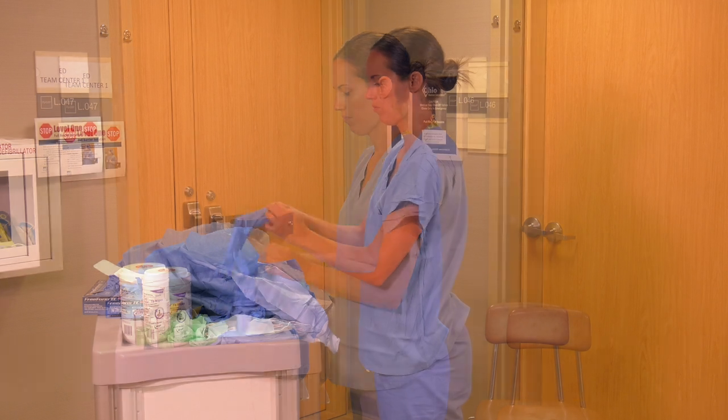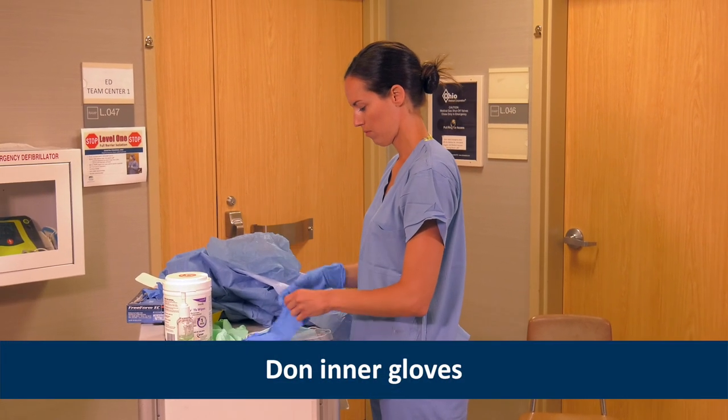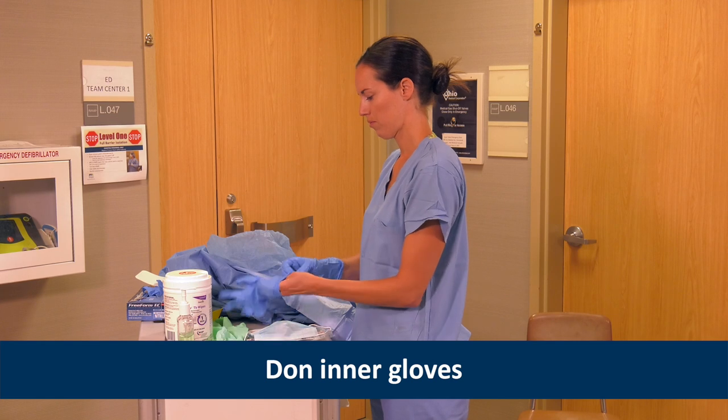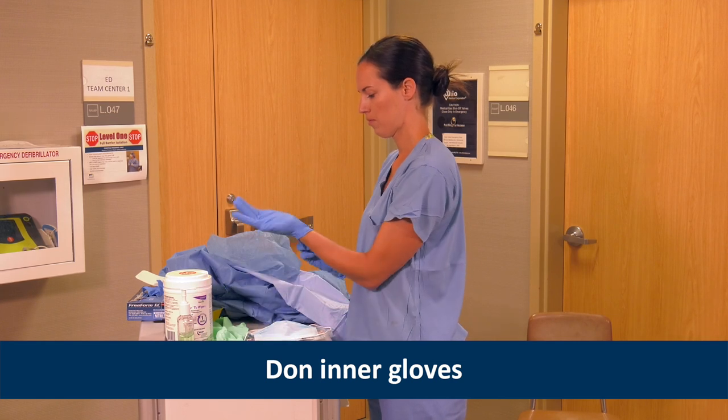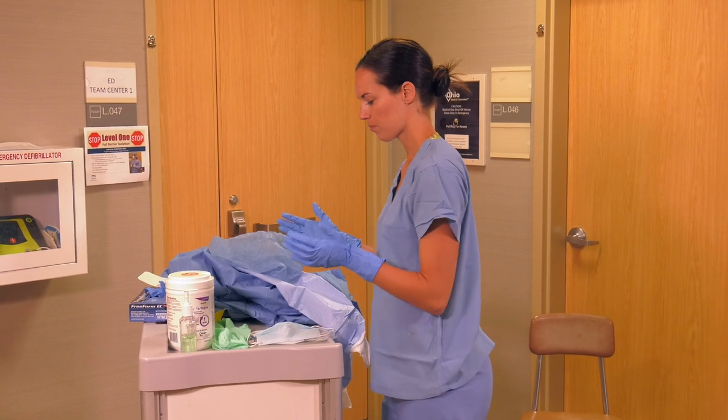Since Heather suspects viral hemorrhagic fever, or VHF, she dons inner gloves with extended cuffs. If a respiratory HCID is suspected, she would put on a single pair of gloves later in the donning process.